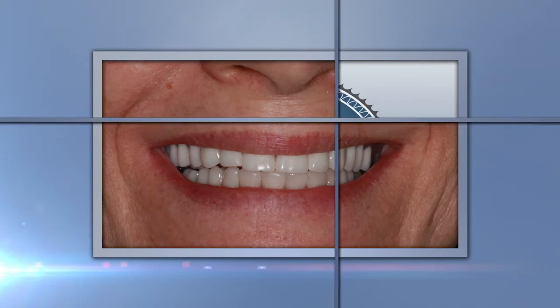I see so many people who have been wearing removable type prostheses for a long period of time, and you can get to a place where you have very, very little bone and run the risk of fracturing your jawbone. So we wanted to prevent that in her case, and that's what we were able to do with this type of restoration. So she has the screw retained connector bar in place, extending off of the back to give support for her removable prosthesis. And this is her with the prosthesis in place.